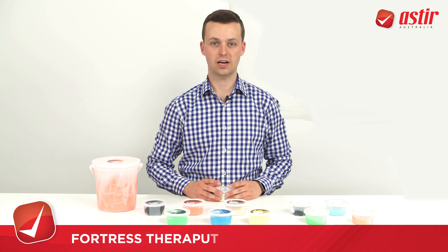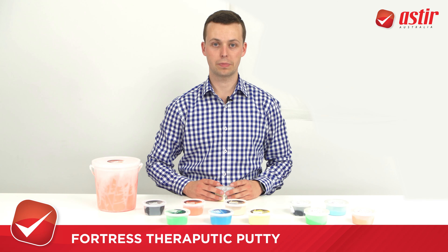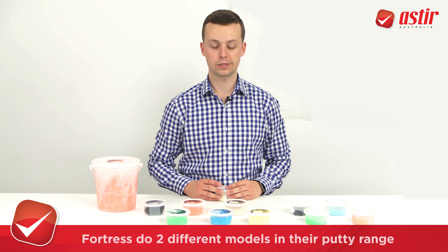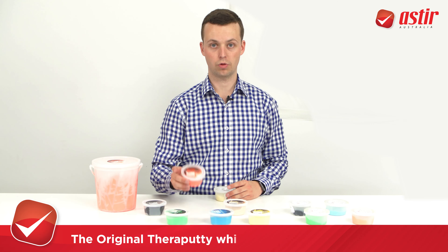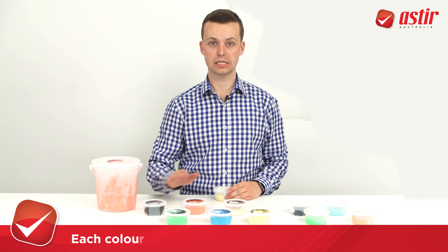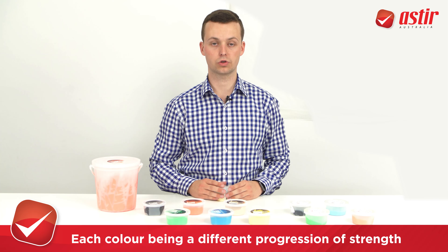Hello, my name is Silas and today I'd like to show you our range of therapeutic putty from Fortress. Fortress do two different models in their putty range. The original putty, the TheraPutty, which ranges from your tan all the way through the colours to your black, each colour being a different progression of strength.